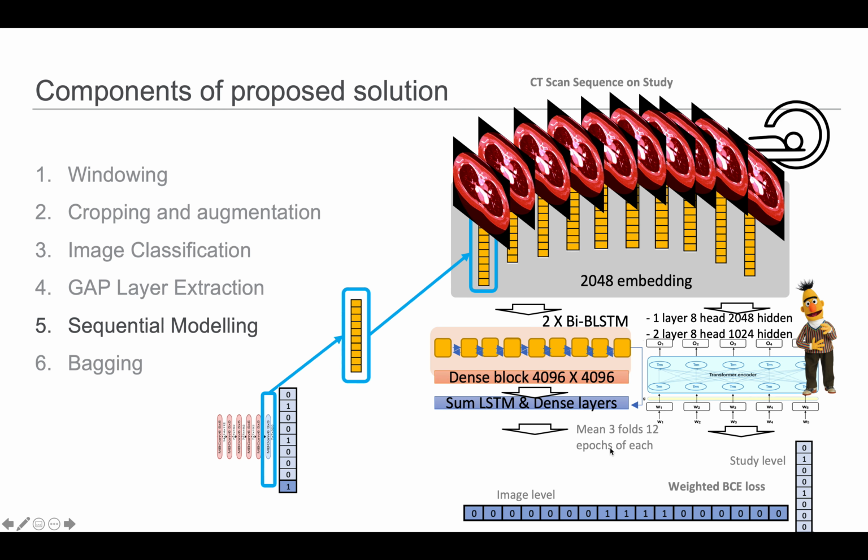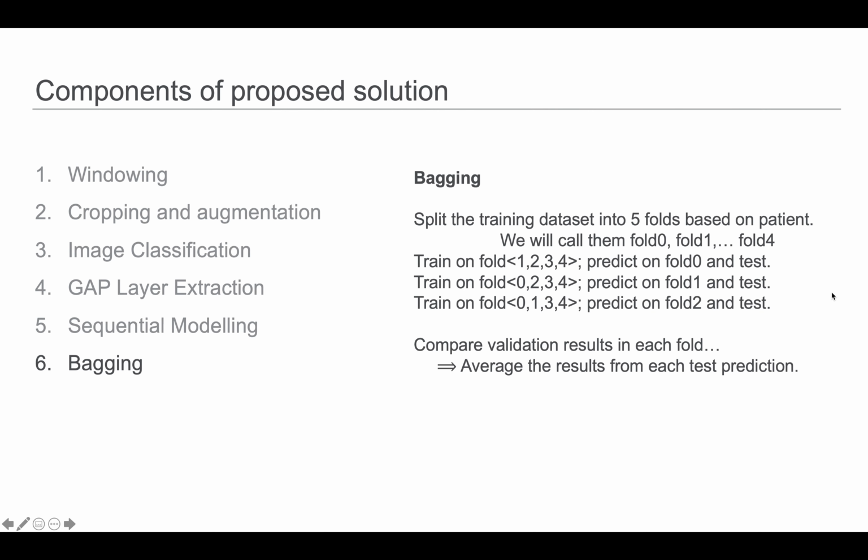The loss function used here was a change on last year, and we tried to get as close as we could to the original loss, the competition metric. Obviously each sample passed in here was a whole sequence, so a single study, a whole sequence of images. Finally, we split the data into 5 folds, and 3 of the folds were used.